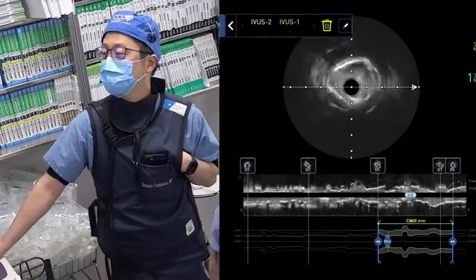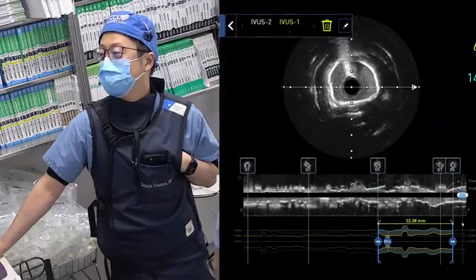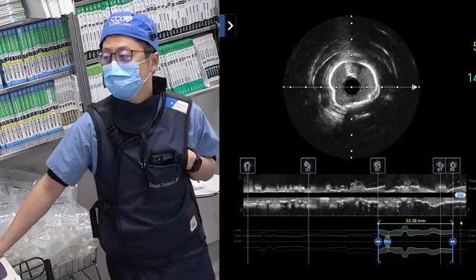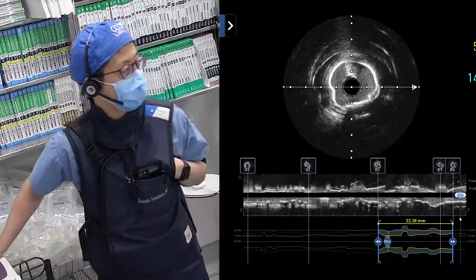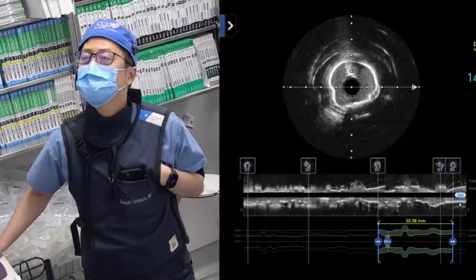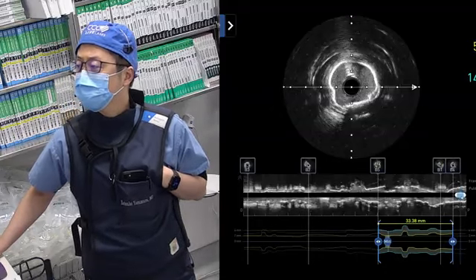Where did we stop? Even right there, yeah. So that's about 5.8. Yeah, 360 calcium, then we will do proximal like this. No, but this is a 3.0. The distal is 3.0. Believe me, 3.5 at moderate pressure and then proximal at little higher pressure will be okay.